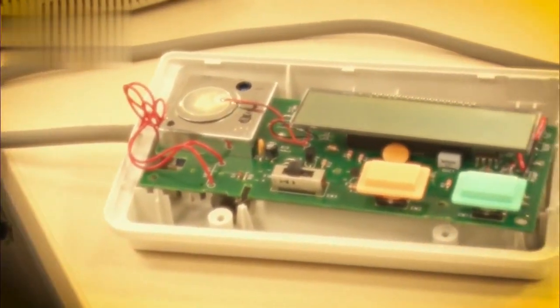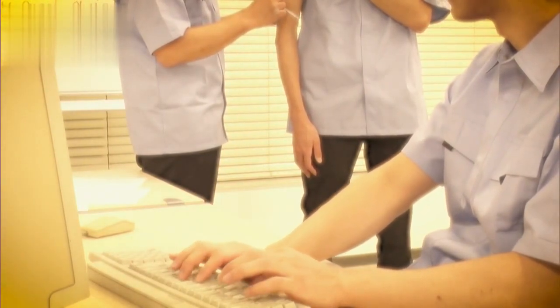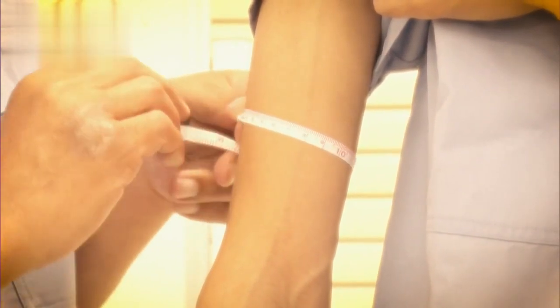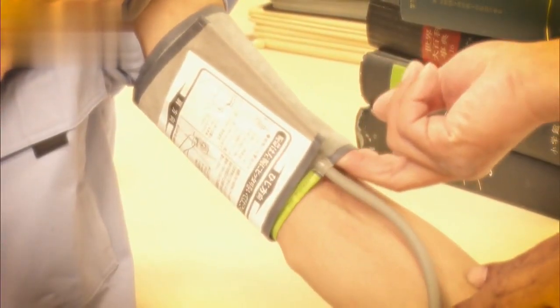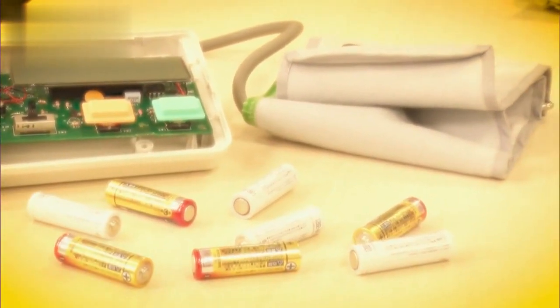To come up with the rules, the team members thought of all the things that would affect the cuff pressure. They decided on these factors: whether the arm was thin or thick, whether the arm was muscular or soft, and whether the cuff was tight or loose. They also had to set rules to govern how the pump would operate and account for the remaining charge in the battery. The team wrote rules to cover as many situations as they could and entered them into the program.